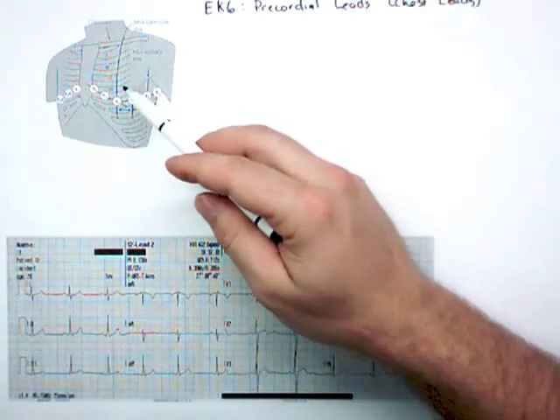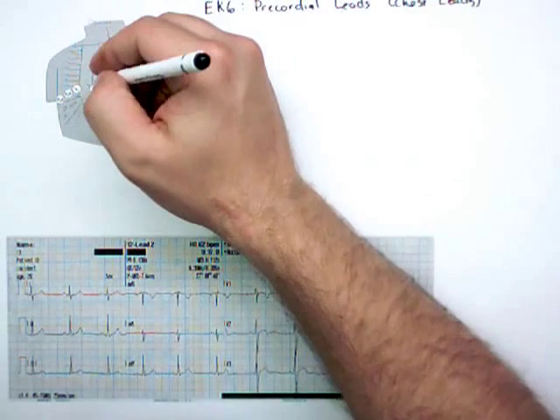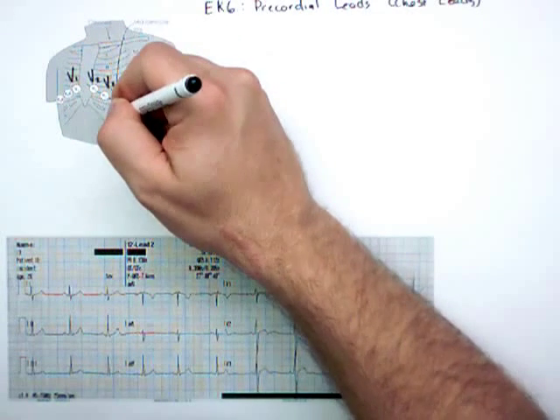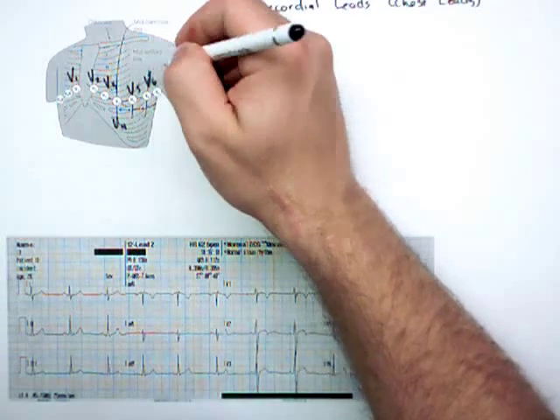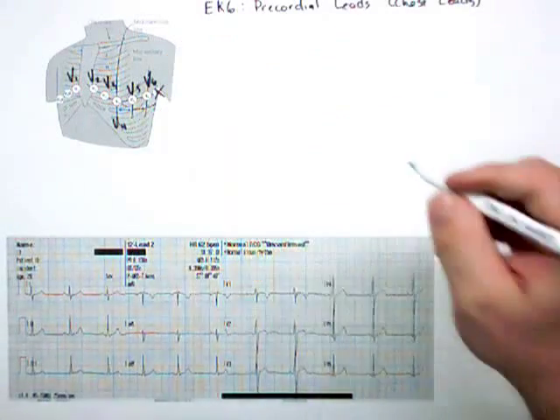Got this little picture from Wikipedia, so it's Creative Commons. It shows you where those leads are. I should probably make this a little bit bigger. This is V1, V2, V3, V4, V5, and usually there's just a V6. This figure has a V7, but there's usually just a V6. That's how we get to 12 leads.